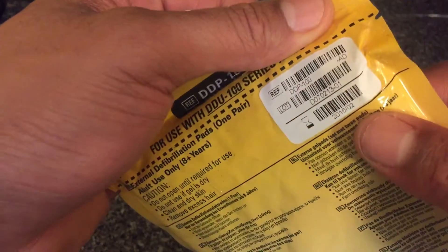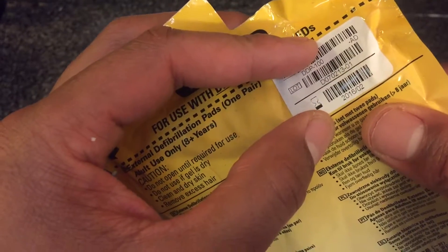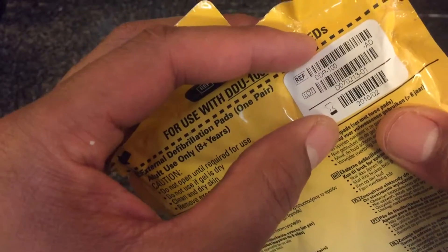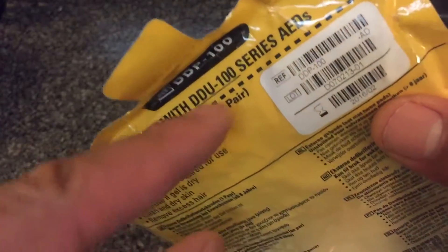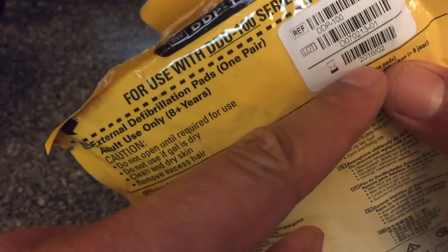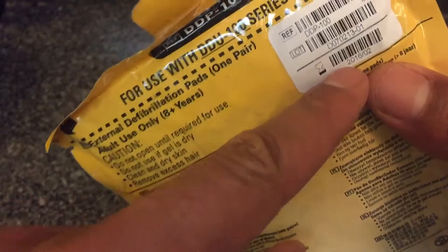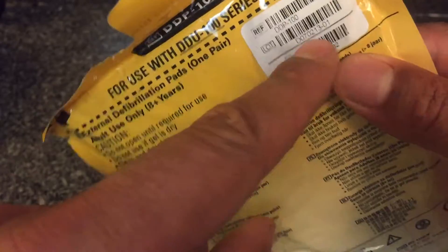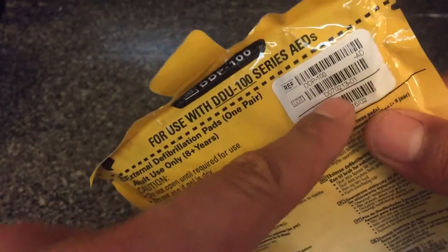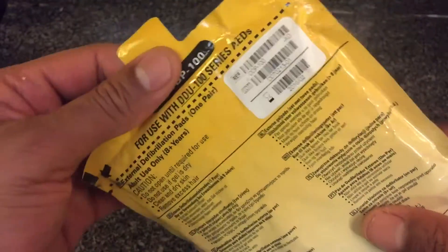On the back it shows you when the pad expires — this pad right here has already expired. You want to replace the pads before they expire. The expiration date is from Defib Tech and they guarantee the pad will be fresh up until that date. After that date they are not liable and you should replace the pad. Check the description for more information about that.